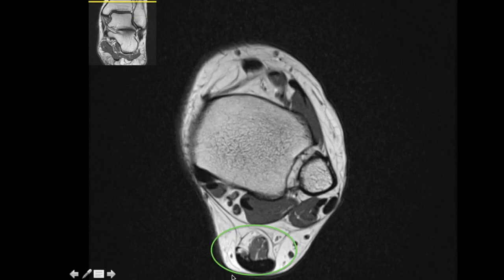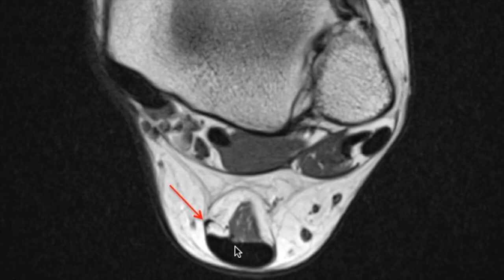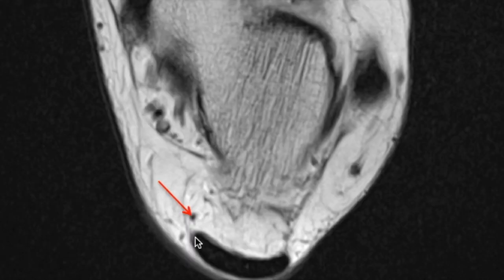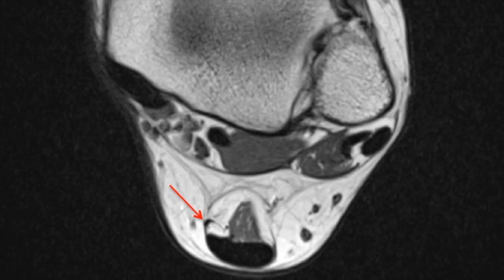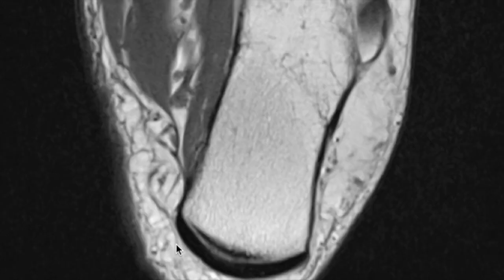The last or fourth compartment is the posterior compartment. This thick jet-black tendon is the Achilles tendon and adjoining it is the soleus muscle. Another important structure is the thin hypointense linear band that goes along with the Achilles tendon — this is the plantaris tendon. It is important because sometimes it is mistaken for a split tear in the Achilles tendon. Going inferiorly, the Achilles tendon attaches to the calcaneum.